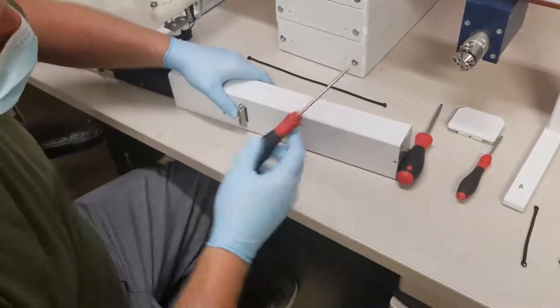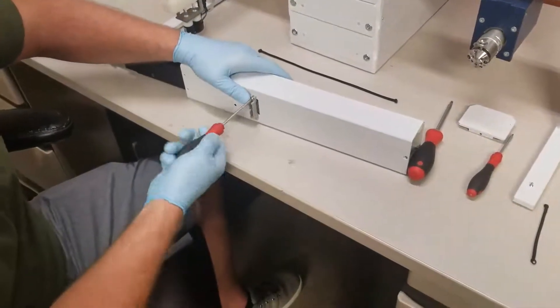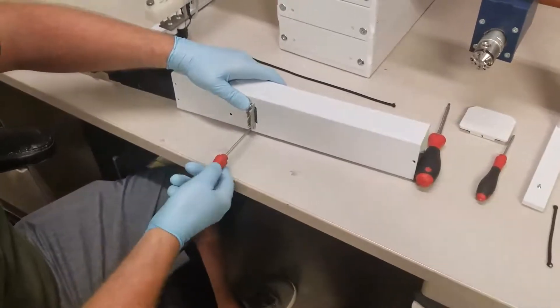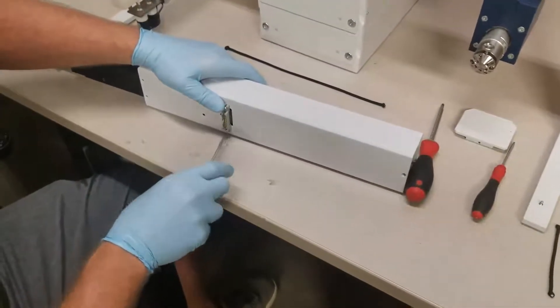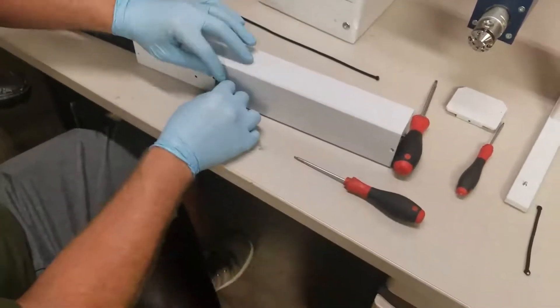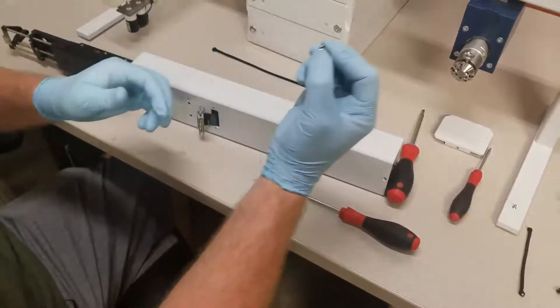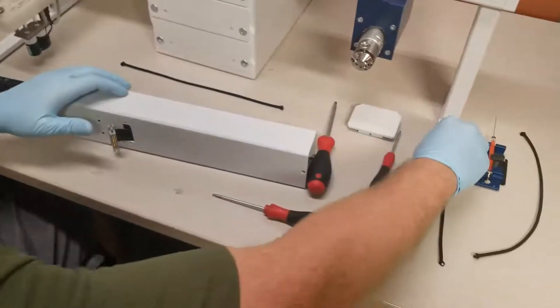Using the same Torx 10, remove the two screws by holding the flat cable clamp in place. These also have very small washers on them, so you want to be careful not to misplace those.